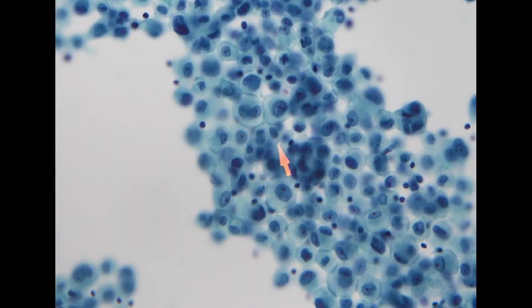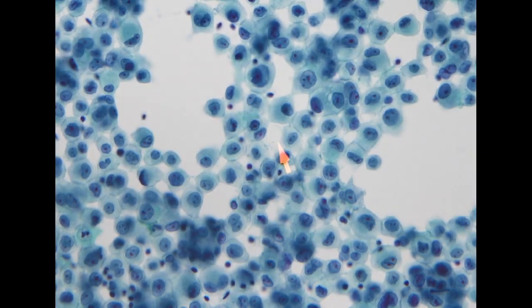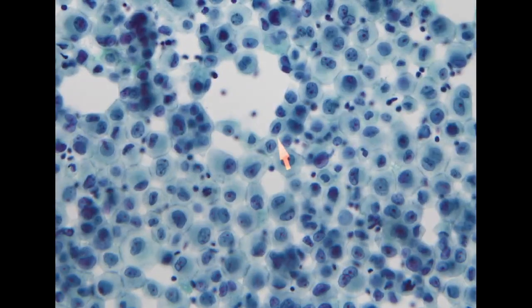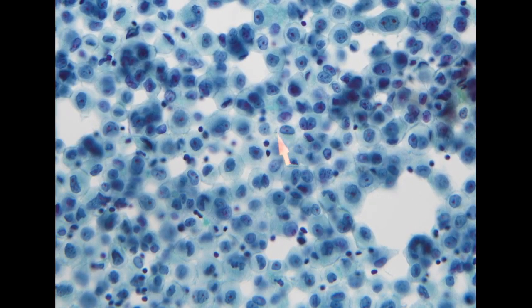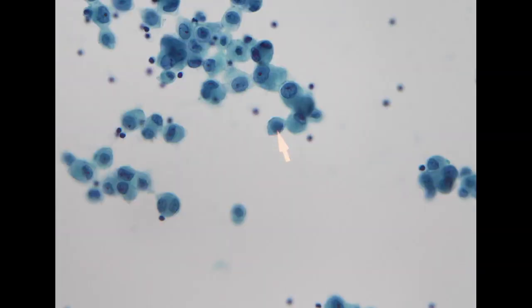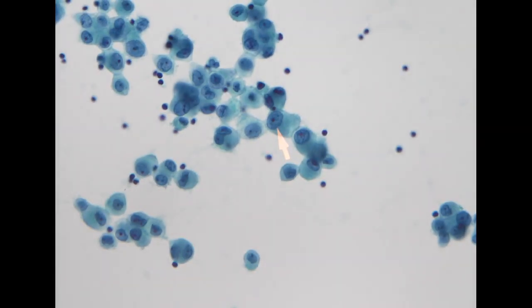So overall, it has high suspicion for mesothelioma, but because the cell ball feature is not very prominent, without any ancillary test we can probably only suggest or suspect that it is a mesothelioma, but we would definitely need some more ancillary tests to confirm the diagnosis.